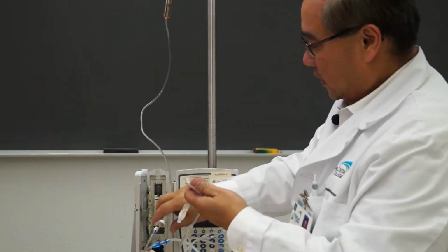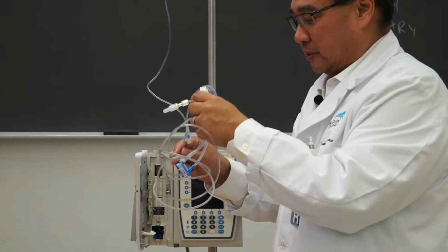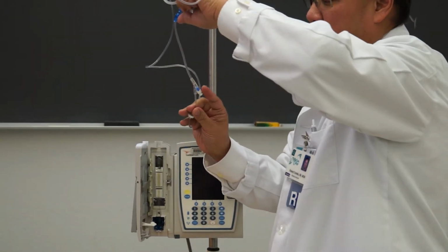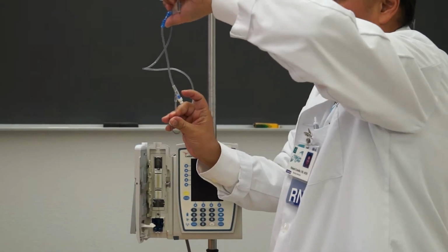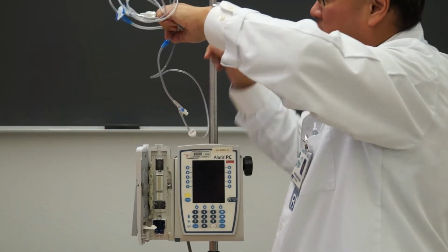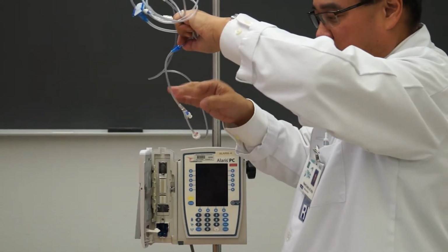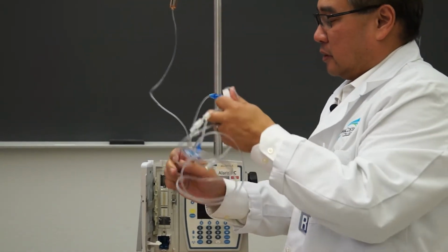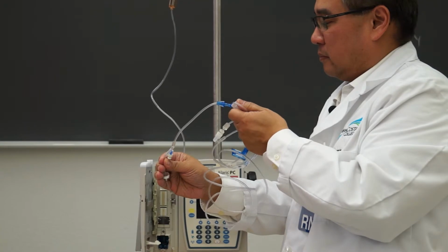Okay, one thing is that when I get to the Y sites, there's also air that could be in the Y site here, not just the tubing itself. So I want to get all the air out. So when this gets to the Y site, you're going to see me flicking it to remove the air out the side here. Okay, so I'm going to hold it this way.